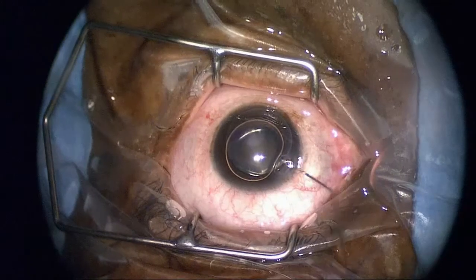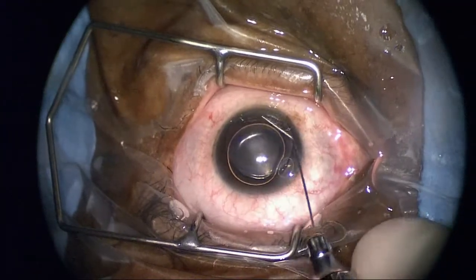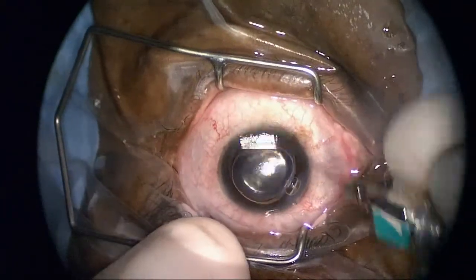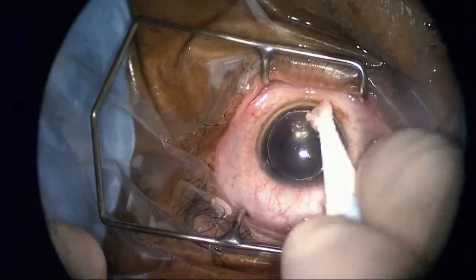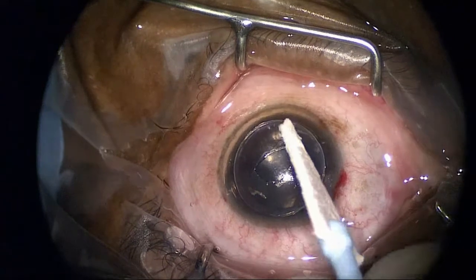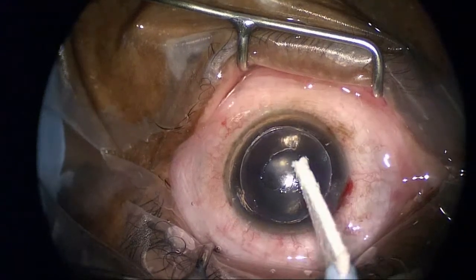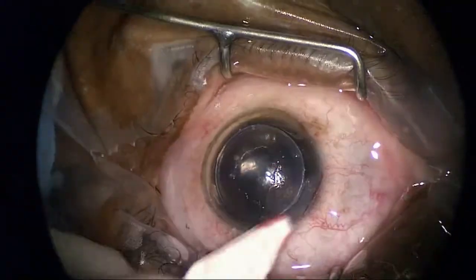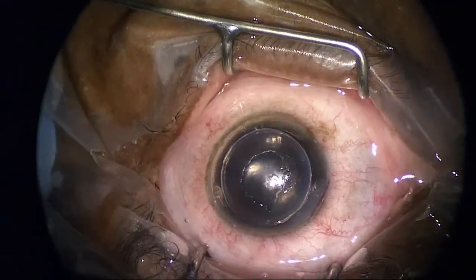This has been a remarkably easy technique for inserting donor tissue. With a little bit of air — just enough to hold the tissue in place — I can ease it into position. Once I get it into the right position, I'll increase the air fill. Now I'm going to take off that loose epithelium. I could have done this earlier to help visibility, but I don't like loose epithelial cells around that could lead to in-growth or downgrowth into the eye.